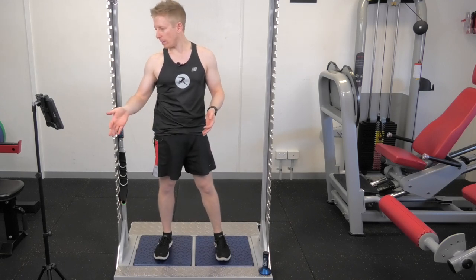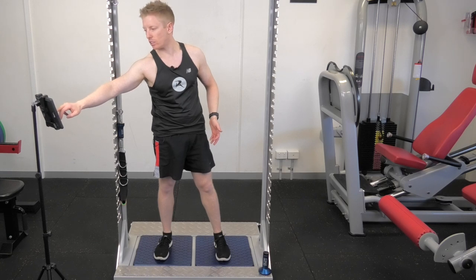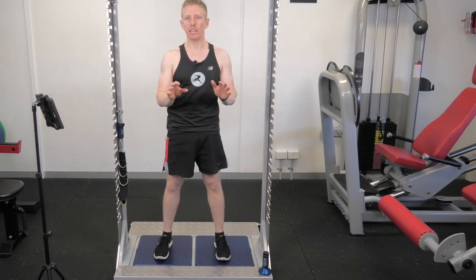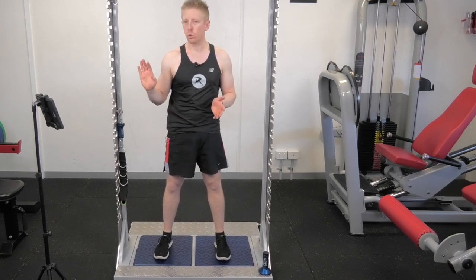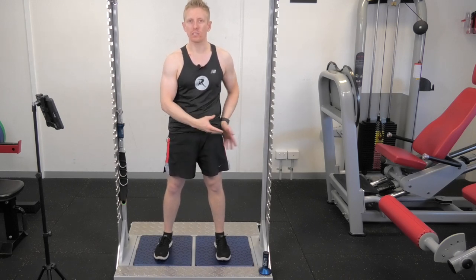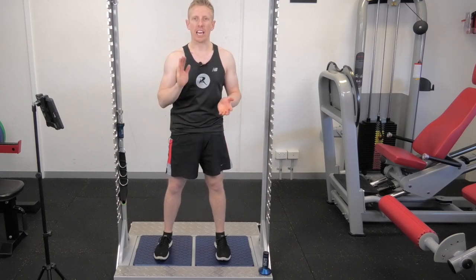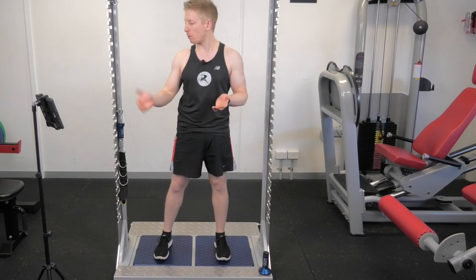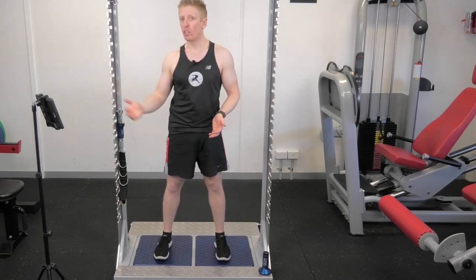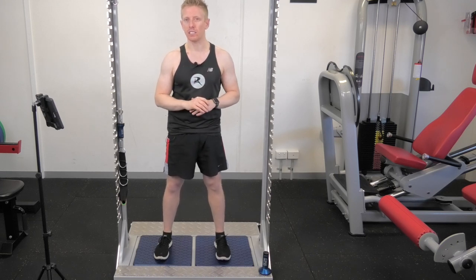It was actually my right leg — I was putting 77 kilos versus 67 kilos worth of force there. But the rate of force development — I was generating force a lot quicker through the left side, 26% more through the left side than the right side. So I'm generating more force through the right, but the efficiency through the left is better, suggesting I'm potentially not as efficient through the right side. I've got to put together all the other data collected through the day.